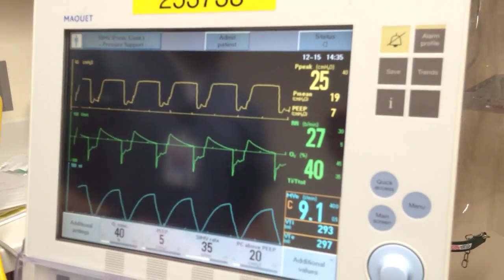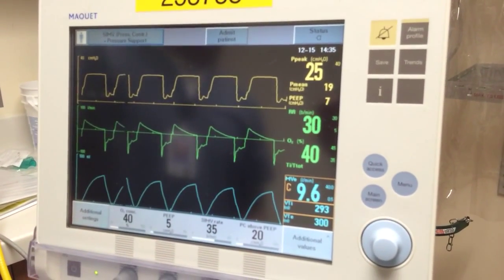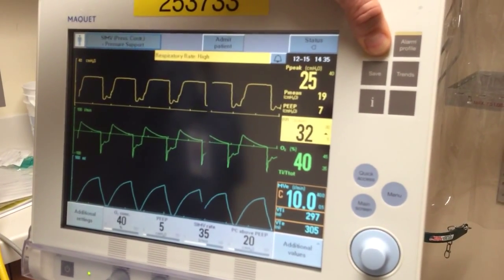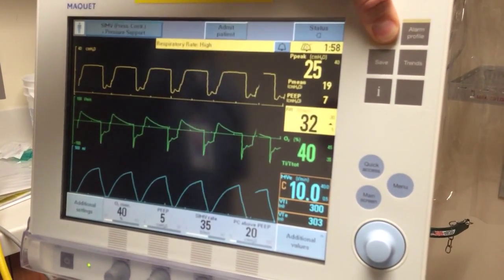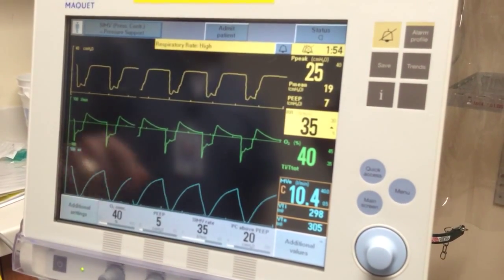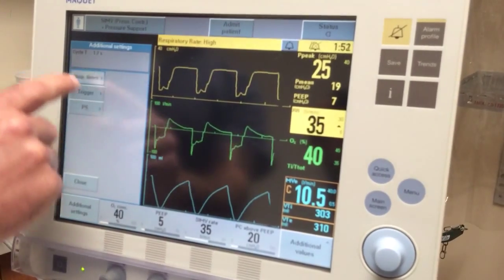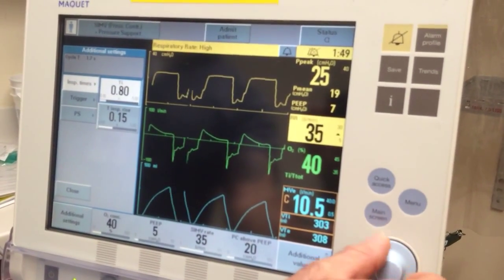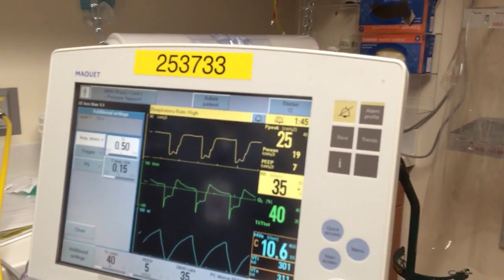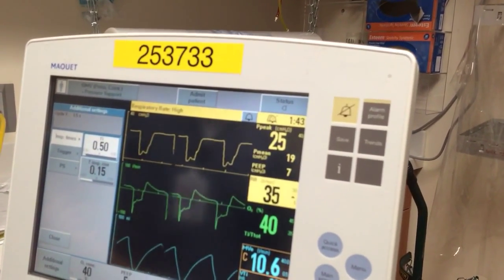So in this situation, because we have an ordered rate of 35, we have to have the physician tell us what I time he wants. Either he needs to come down on the rate so we can get to 0 flow on the I time. If he's not comfortable with that, then we need to have him tell us what I time we have to set so that that trap doesn't happen, or he's good with that trap happening, but he still needs to order the I time.